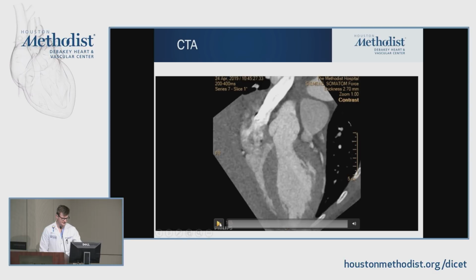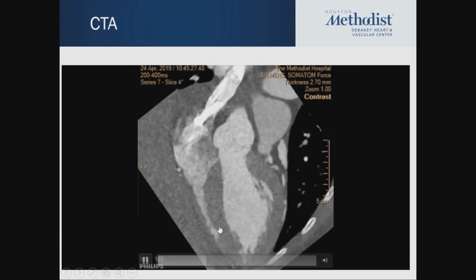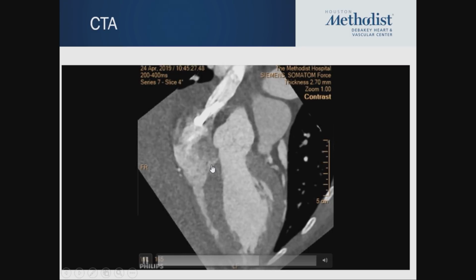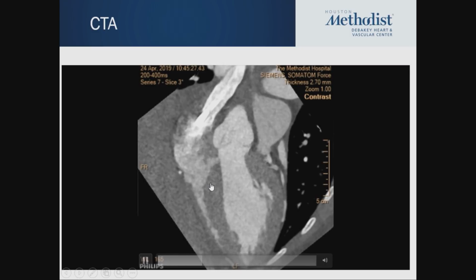The cine image was scanned prospectively, and there are basically only 4 time points, but you can still see contrast flowing from the left side to the right side, and the tricuspid valve moving and tilting towards the atrium.